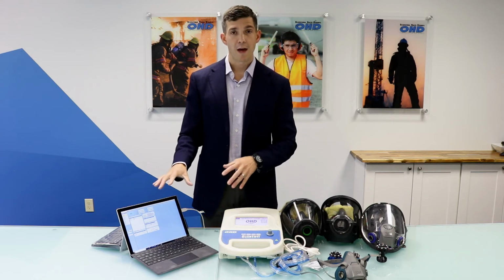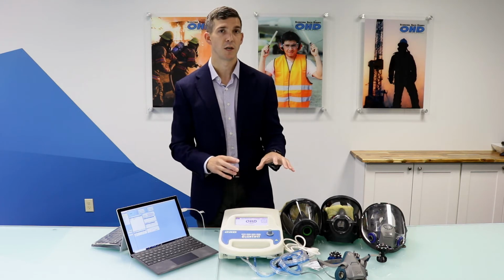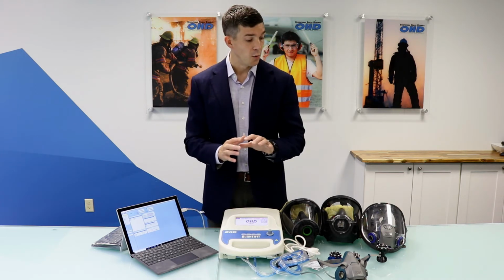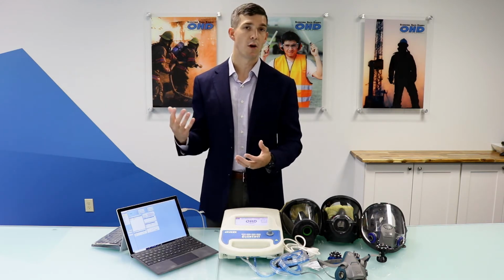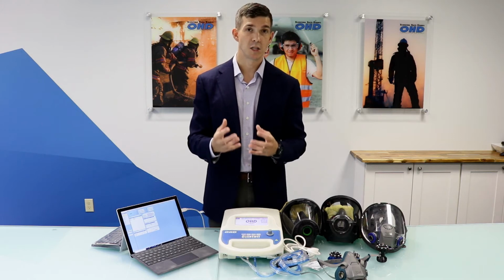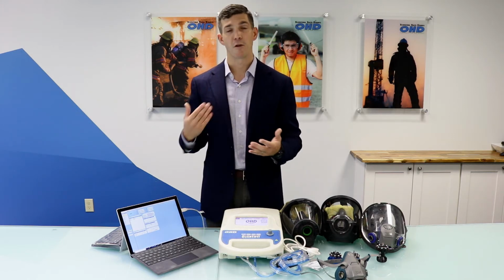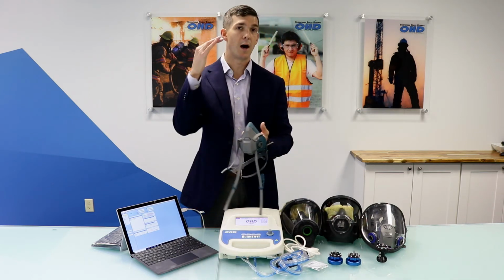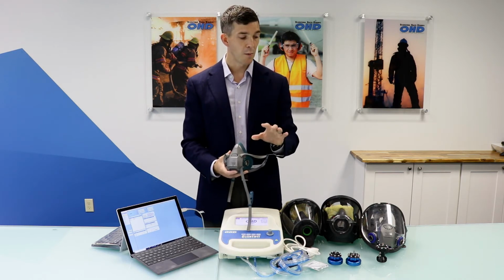So we've done all that now, but before we jump into the software and fit testing, let me show you connections up to respirators, and then we'll jump into an actual fit test. So the QuantiFit can test all elastomeric mask up to CBRN level mask. We cannot test disposable respirators right now because when we pull a negative pressure, the air flows straight through the filter material. So anything that is half mask and up, you can fit test with this technology, with controlled negative pressure.